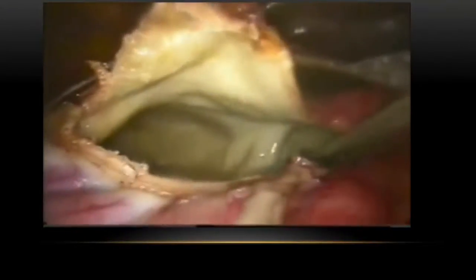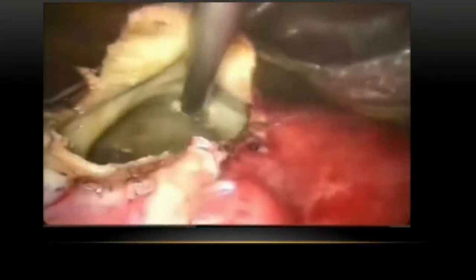And the entire capsule has to be left in. Removal of the capsule causes unnecessary bleeding, and it is not necessary because recurrence doesn't happen due to the retained physiological capsule. So marsupialization you can do, the margins you can burn. In open surgery, marsupialization is done by running suture, inverting, but in laparoscopy, if you are burning the margins with the bipolar, we say that also as a marsupialization.